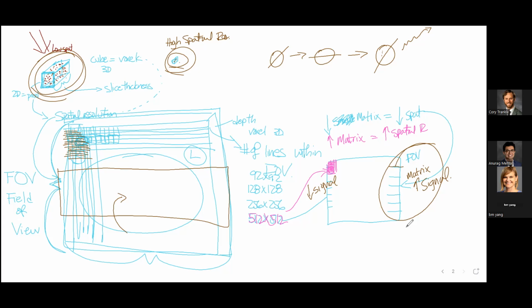But fundamentally, up inside the bore of the scanner, that magnetic field makes all the protons in our body line up in a specific orientation, every single one. The more protons you've got in there, the better your pictures. If a big person can fit in the hole, there are better pictures. There are more protons. But fitting in there and being comfortable, if you push up against the bore, it gets real tight. So that's not a big limitation for us.